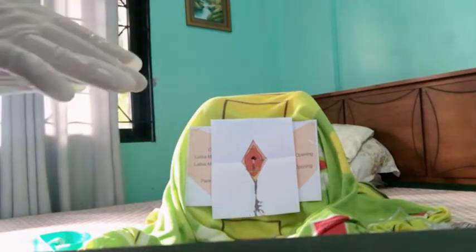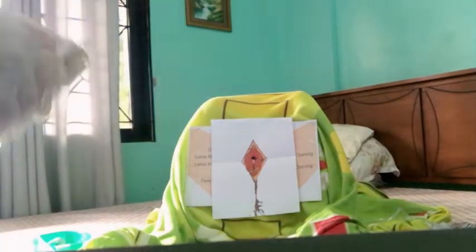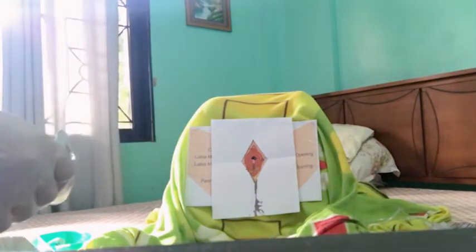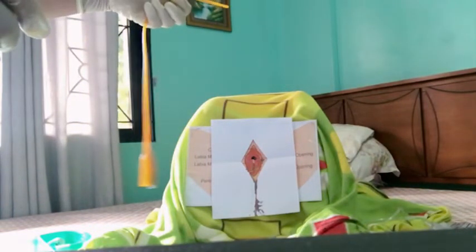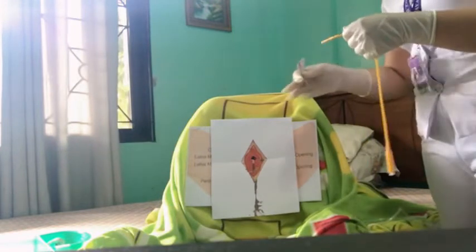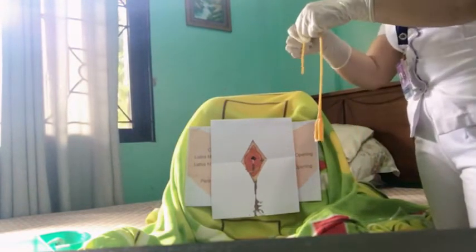Be careful not to plug the eye of the catheter, because lubrication will help with the friction and prevent urethral trauma, thus reducing pain upon insertion. So pick up the catheter at least 3 inches from the tip, with the thumb. Then place one finger of the left or right hand between the labia minora. So we'll just put our lubrication first.